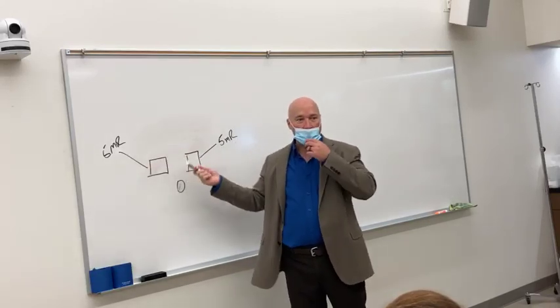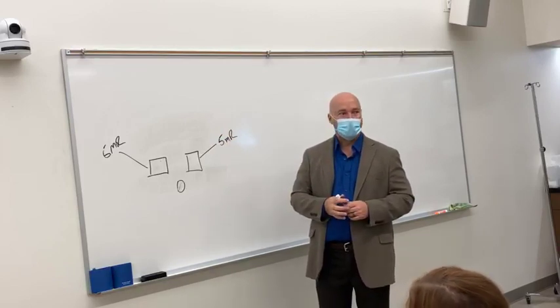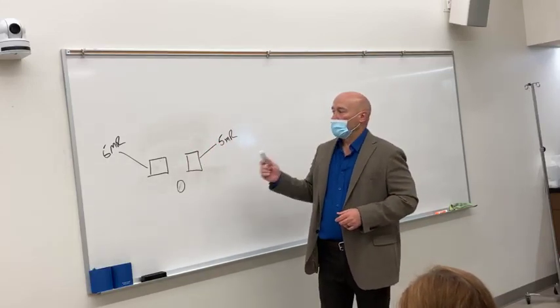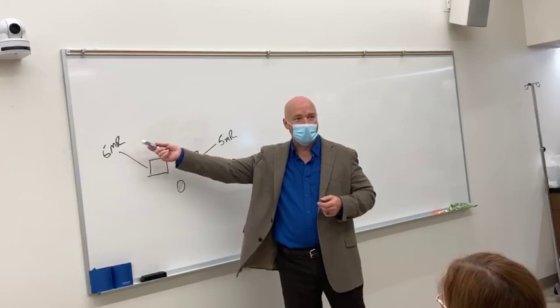Can these see the patient and determine that you've got a hypersthenic patient versus an asthenic patient or a hyposthenic patient? No. These things don't have a camera on them, they can't see. Okay? So we make an exposure on the hypersthenic patient. What do these things want?